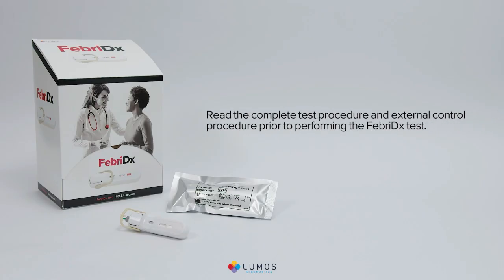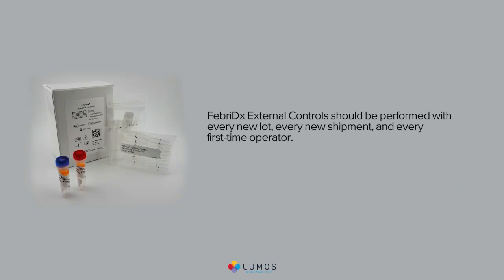Read the complete test procedure and external control procedure prior to performing the Febridex test. Febridex external controls should be performed with every new lot, every new shipment, and every first-time operator.